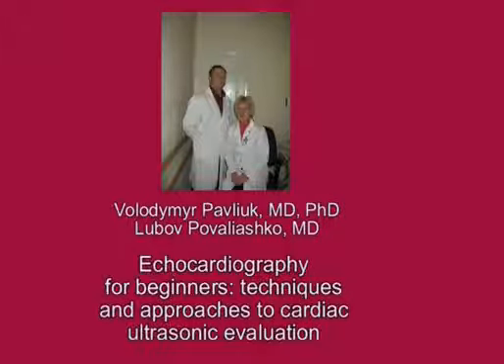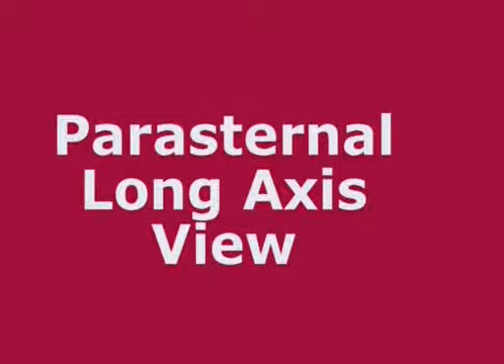Echocardiography for beginners. Techniques and approaches to cardiac ultrasonic evaluation. Parasternal long axis view.